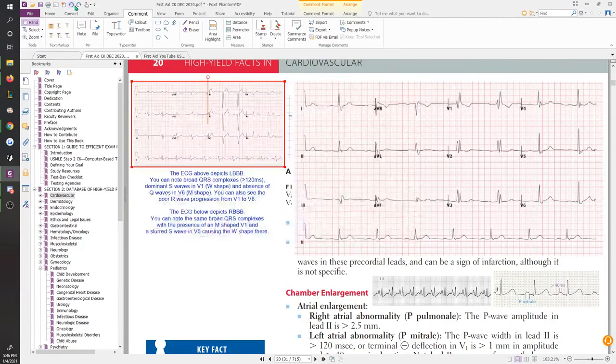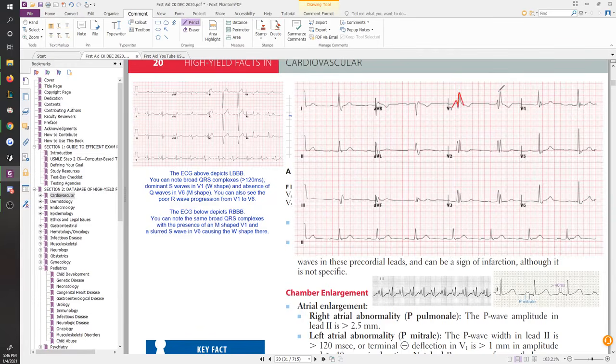Right, so let me make this small and put it away and then grab my pencil. And clearly on this V1, I can see the M. It's very apparent, right? And then if I come to V6, as I said, the W is often much harder to see, and you don't really see a very concise or clear W, so you let it be, right? But you see the M.